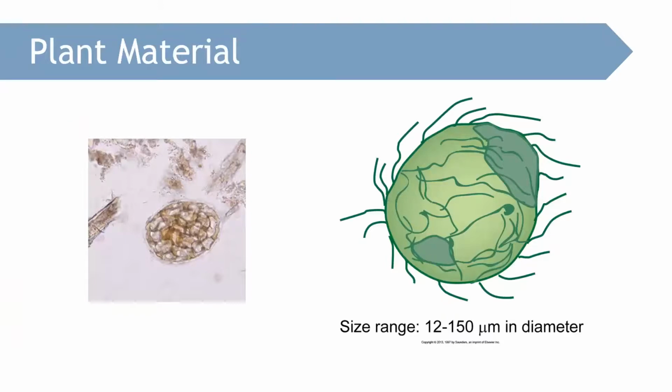Plant material such as this one often resembles a helminthic egg. Doesn't it look like a hookworm egg? But it is not a hookworm egg, because it is just plant material. Okay?